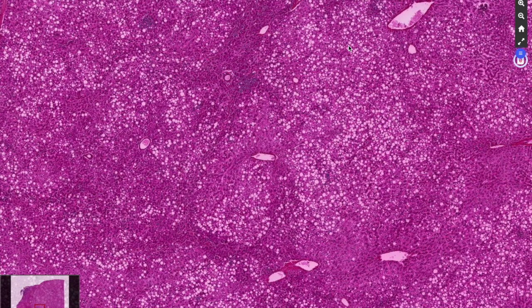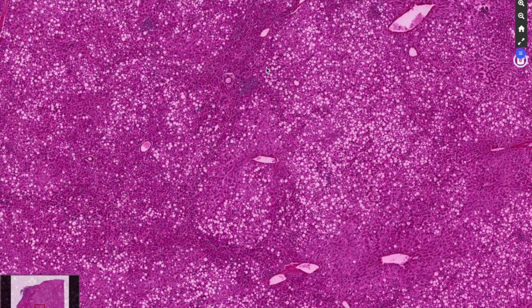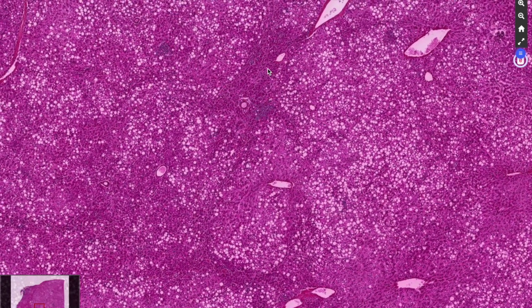called a steatotic adenoma, which shows loss of LFABP protein by immunohistochemistry. There is the inflammatory adenoma, which is the most frequent, which shows overexpression of CRP and SAA. By the way, I recommend CRP immunohistochemistry, much easier to interpret than SAA.